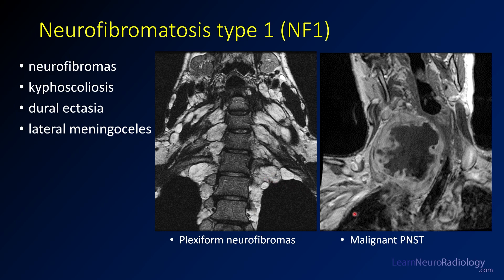Sometimes these neurofibromas can degenerate into malignant nerve sheath tumors. Here you see an enhancing mass with a centrally necrotic region — it's a very large lesion. The key features you're looking for if someone has degenerated: you're looking for one that's increasing in size rapidly, looking for central necrosis, and looking for evidence that the patient has pain. These are features of malignant degeneration.